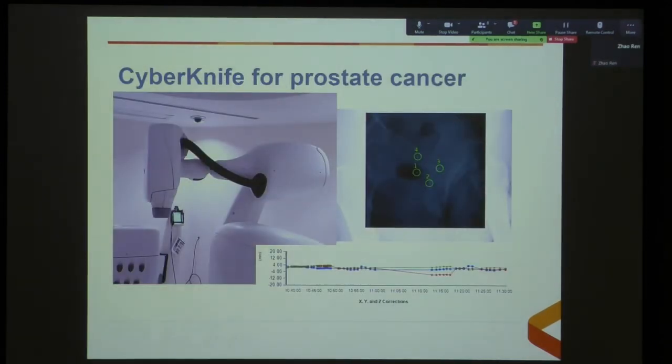So that brings me to the work that I'm doing at the moment. Traditionally with CyberKnife treatment, prostate cancer patients are implanted with usually 4 gold seeds, the fiducials. That allows periodic imaging to pick up the placement of the fiducials and send back in the 3-dimensional plane and also in rotations about the 3 axes back to CyberKnife, so that CyberKnife then can correct its positioning for any internal organ motion that occurs whilst the patient is being radiated.